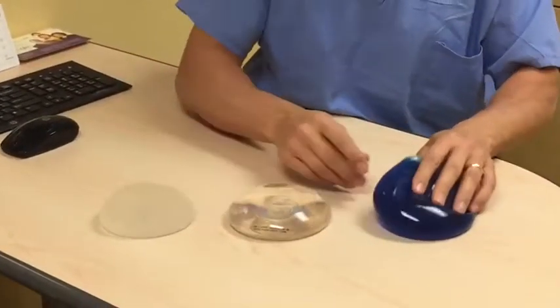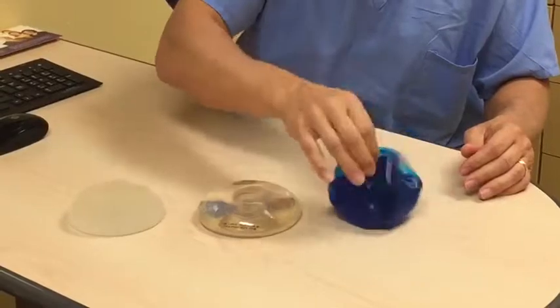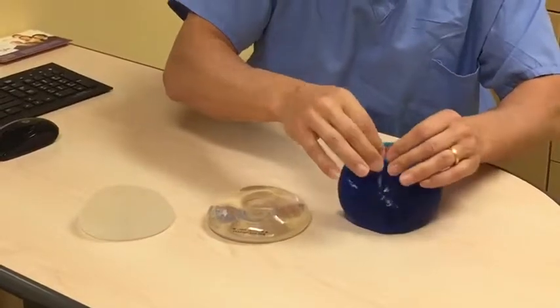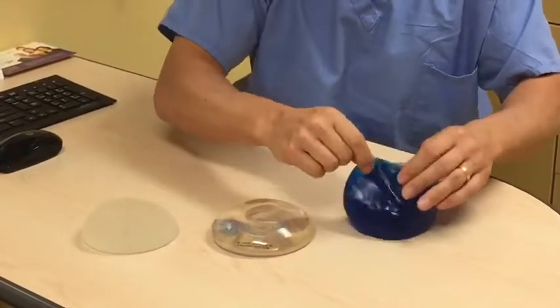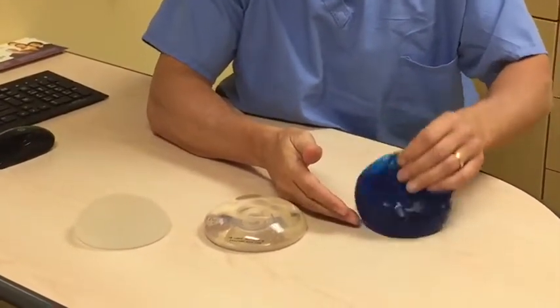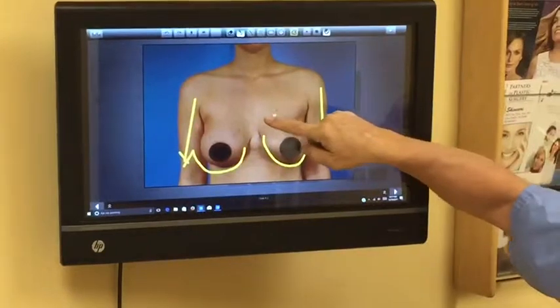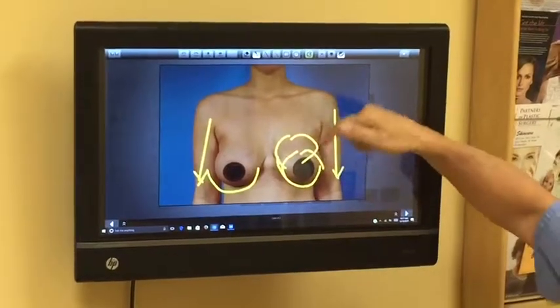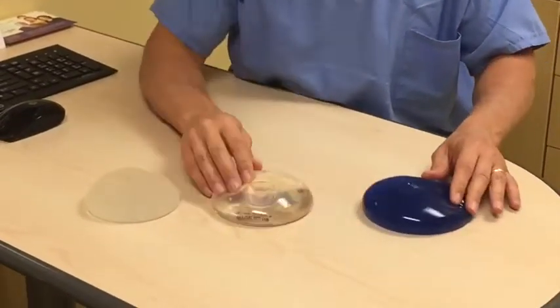Well, you can see what these are going to do in the body simply by lifting them up and letting them drop down. When a patient has a saline implant in, every step that she takes, all of the weight of the saline is directed to the bottom of the breast. And over the span of years, this constant pounding of that saline against the soft tissue leads to this kind of a situation where the implant, which initially was up here, is now down here as it stretches that soft tissue, and then the breast has a saggy kind of appearance. This is one of the main reasons why I try to avoid using saltwater filled implants if at all possible.